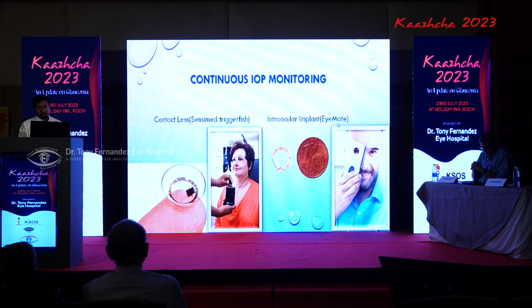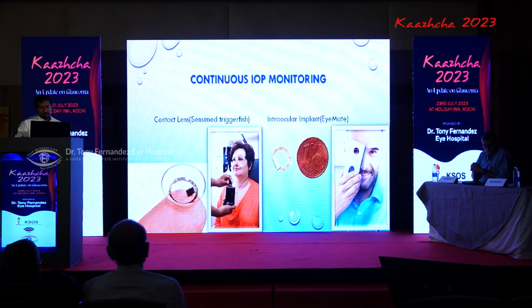There's also one more product, an intraocular implant which goes into the anterior chamber and can measure 24-hour intraocular pressure. But these are very expensive, and this has been in several trials, and I think it is used in LV Prasad also. This one I haven't heard from recently, but these are all the newer things available. Thank you.